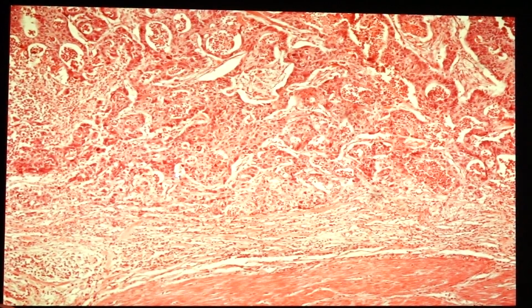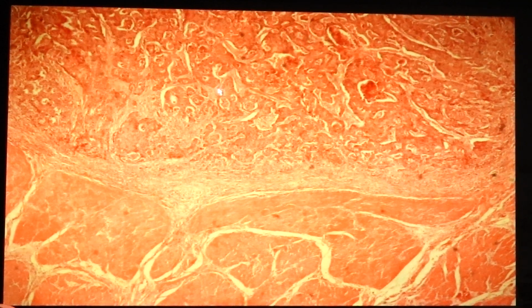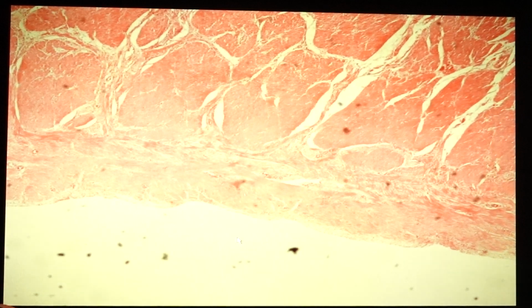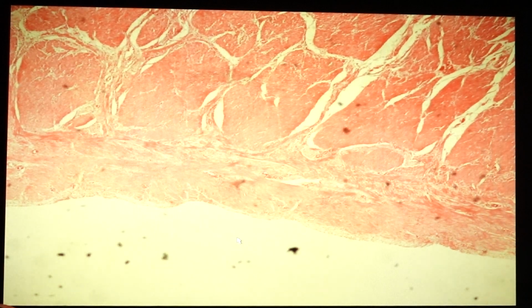So for adenocarcinoma of the stomach, important prognostic factors would be the presence of a lot of glands, which would mean that it's well differentiated. The presence of the invasion. So depth of invasion is very important. We have to look at infiltration into the muscular layer, as well as the presence of lymph node metastasis. Okay. So next we have slide 232.